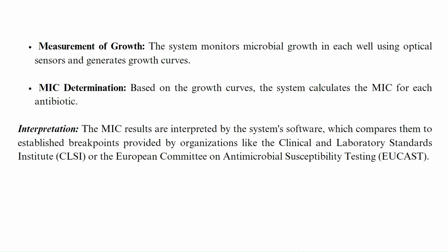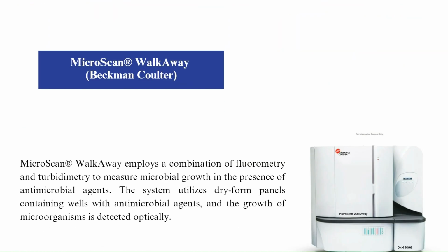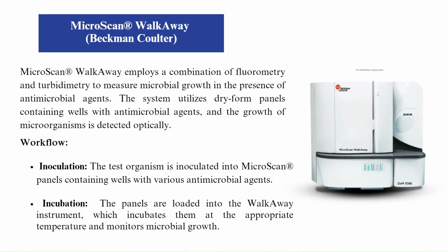The MIC results are interpreted by the system's software, which compares them to established breakpoints provided by organizations like the Clinical and Laboratory Standards Institute, CLSI, or the European Committee on Antimicrobial Susceptibility Testing, EUCAST. Next is the MicroScan WalkAway system.